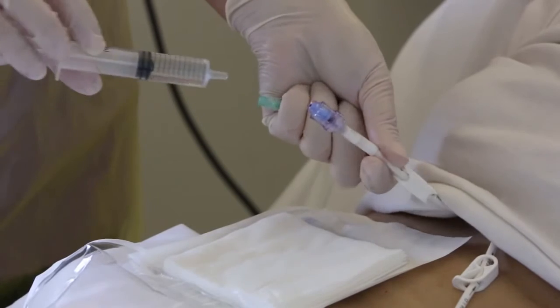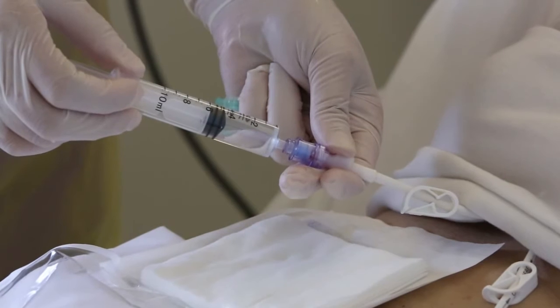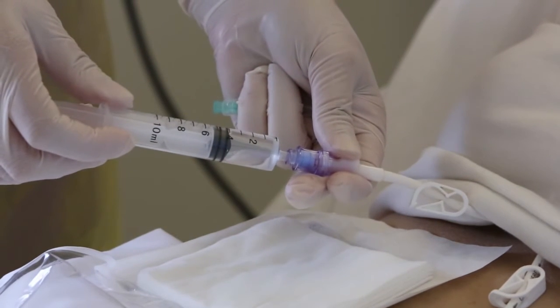Obtain the drug-filled syringe from your tray, remove the needle and attach to the port. Slowly push through the drug. Note that different drugs may require to be given at different rates.